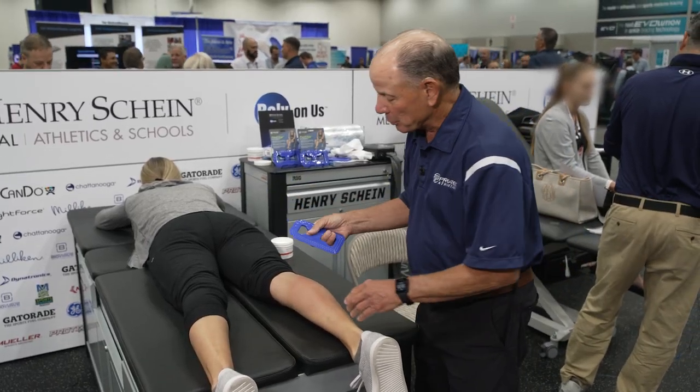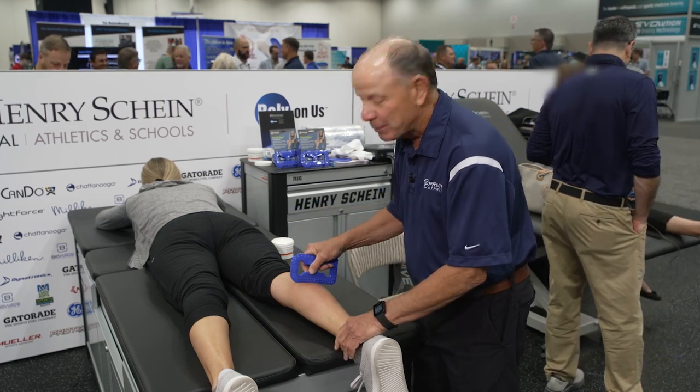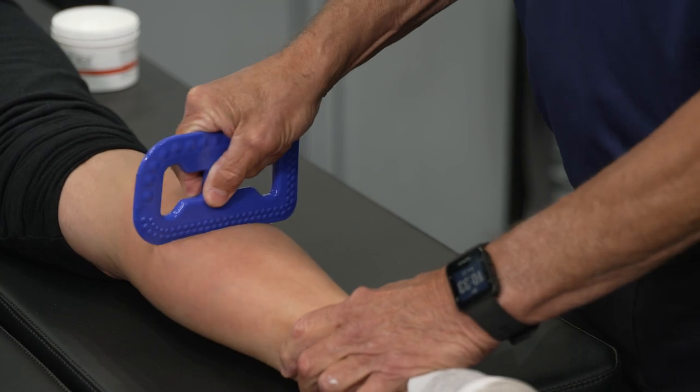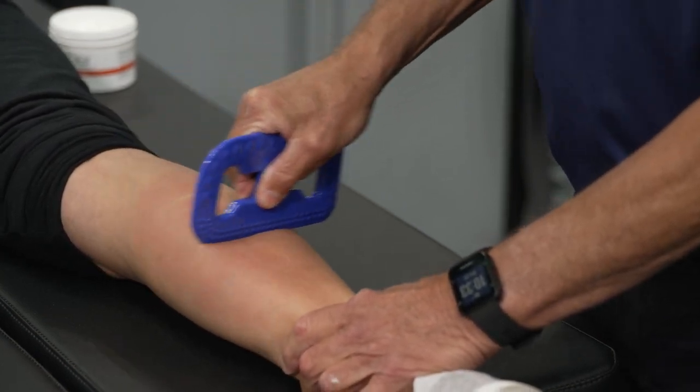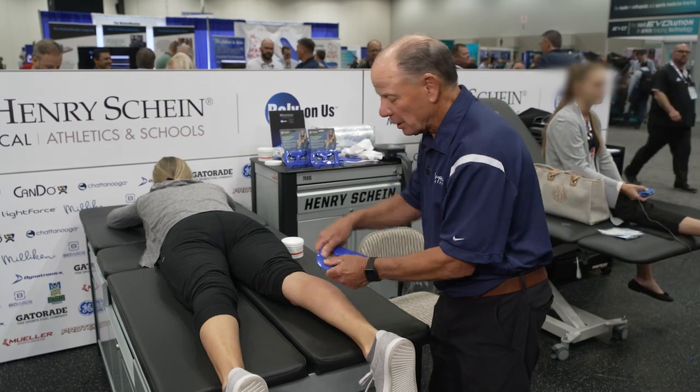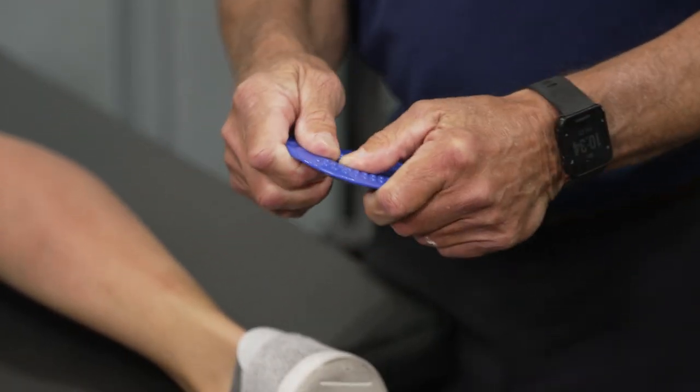I could also use a single-handed grip and just use a straight edge for this pin and release technique. What I'm doing is rolling layers of soft tissue over each other, trying to break up adhesions. I could also use a radius edge to do this technique, with my thumbs lifting up on the instrument.